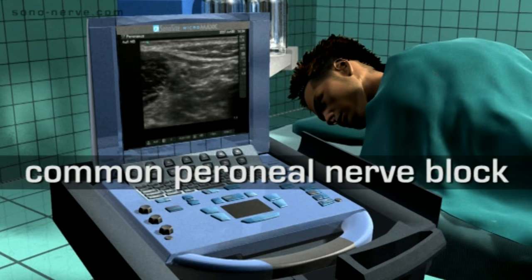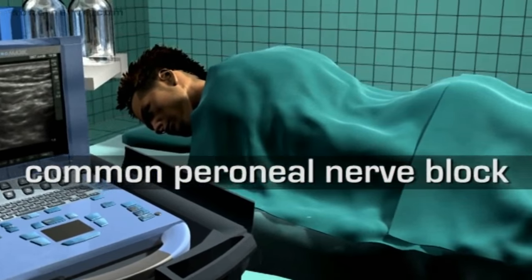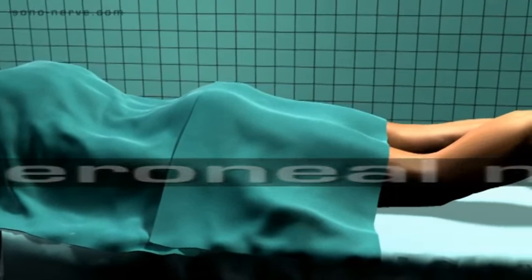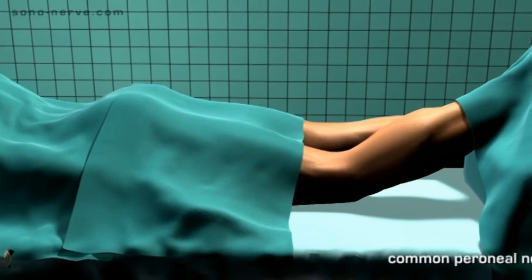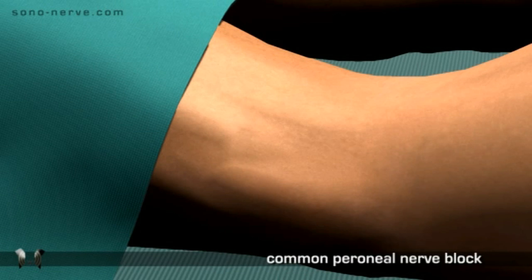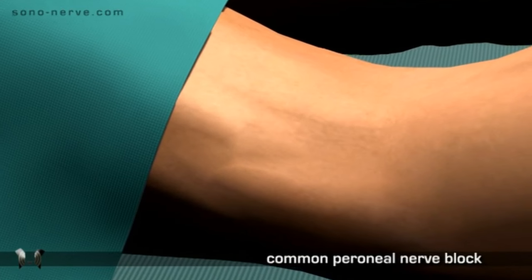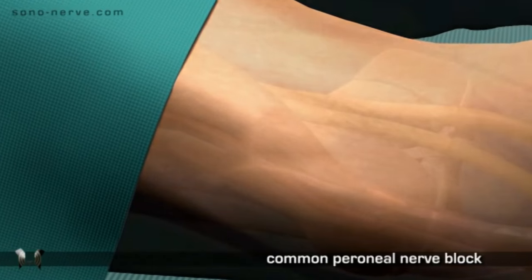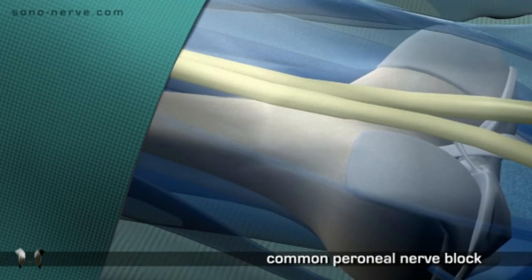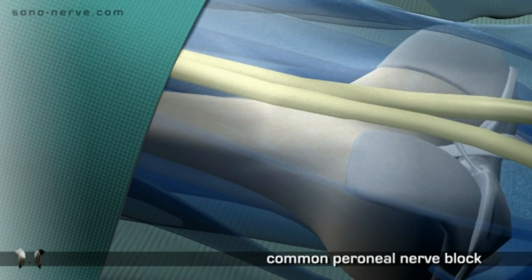Common peroneal nerve block. The patient is placed in the prone position. Supports are used so that the knee is slightly flexed. The common peroneal nerve is a relatively superficial nerve lying at one centimeter or less deep to the skin.